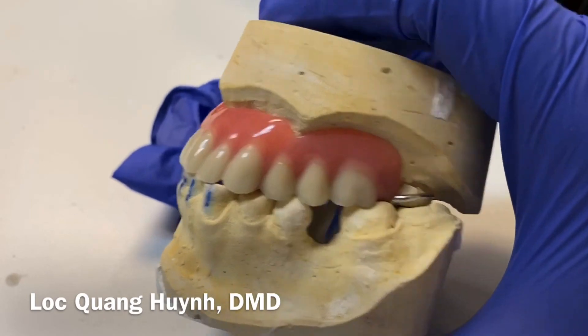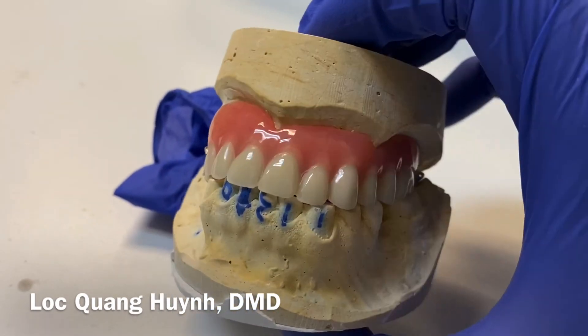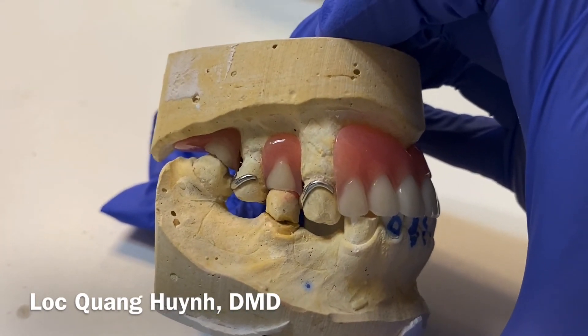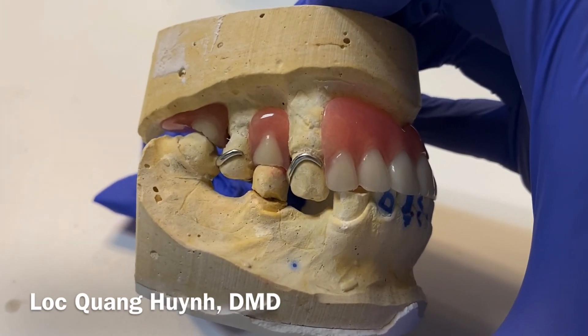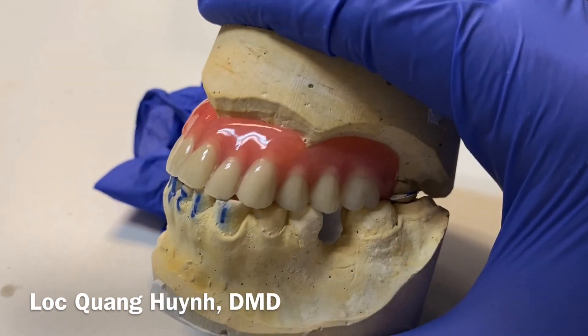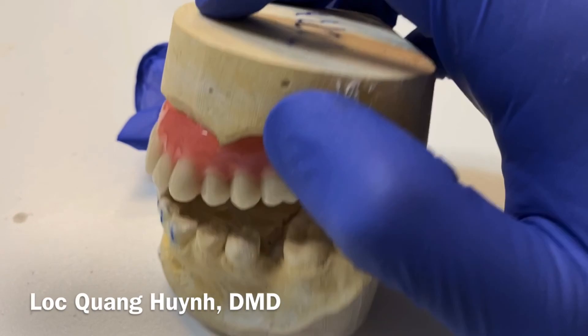Again, this is an introduction and illustration of a partial denture — how the partial denture looks like. I hope you have a great day. Follow us on our YouTube channel so we can see more different things about dentistry and how dentists can help patients in their daily dental care and life.